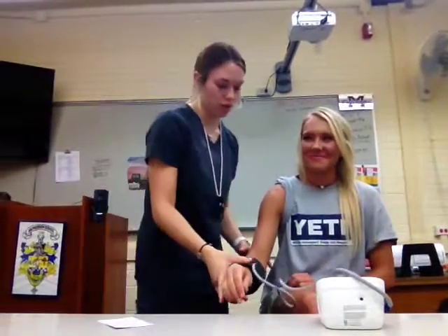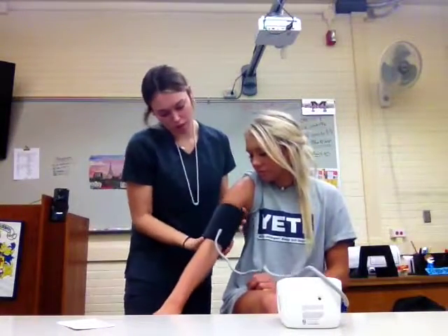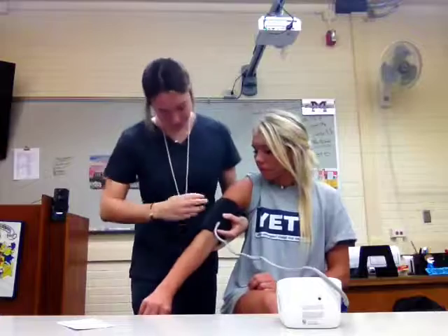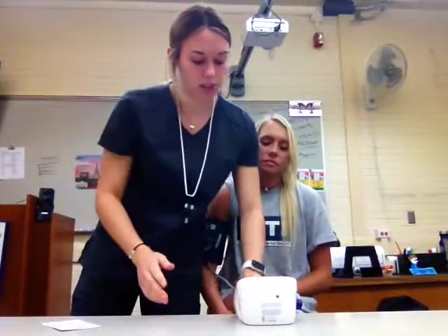So, the first thing you want to do when taking blood pressure is use your arm. I'm going to roll up your sleeve. Bring out the gun show. You want to wrap the cuff around the patient's bicep muscle as tight as it can go. Tight enough? Mm-hmm. Okay. And as I press start on here, I'm going to tell you how to take it with a manual cuff.